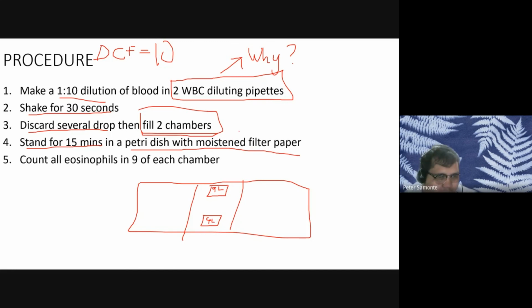Why is there moistened filter paper, class? This would be to prevent drying of the chamber. Why do you need to let it stand?